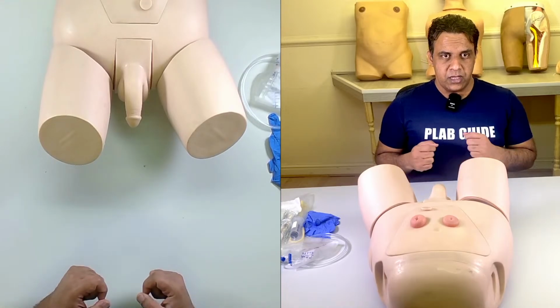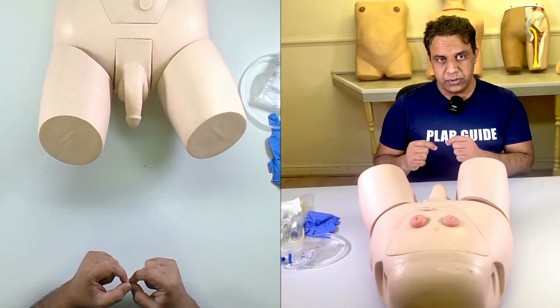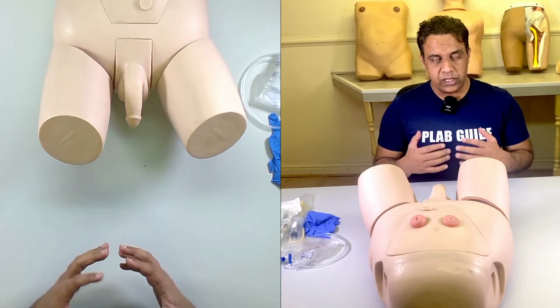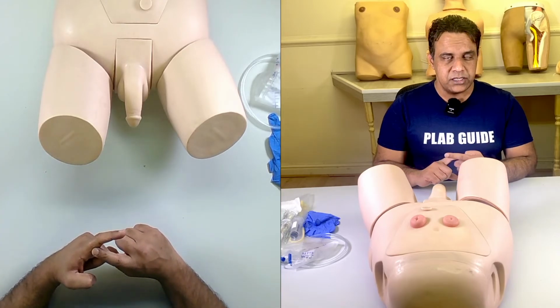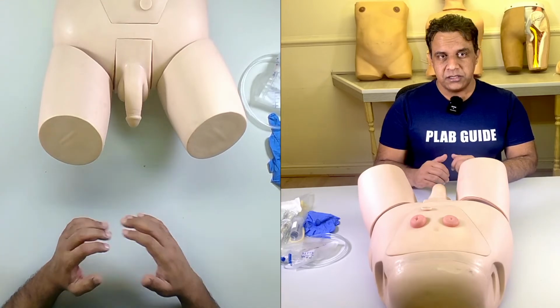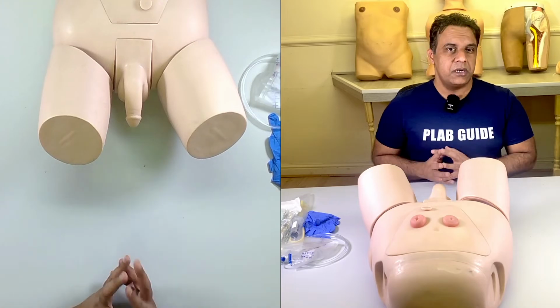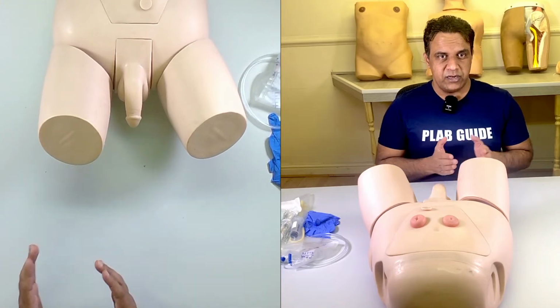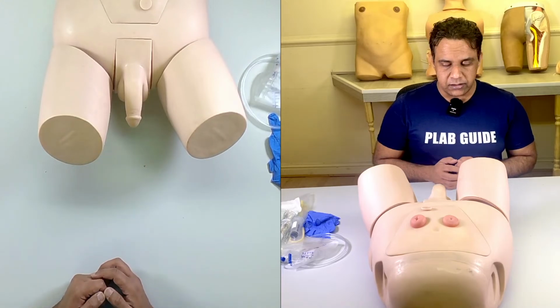The important thing about this is it has to be sterile. There are a few things that you need to consider before you catheterize a patient. Always check the allergies, especially the latex allergy, because the catheter is made of latex. If the patient is allergic to latex, you will need to choose a silicone catheter.